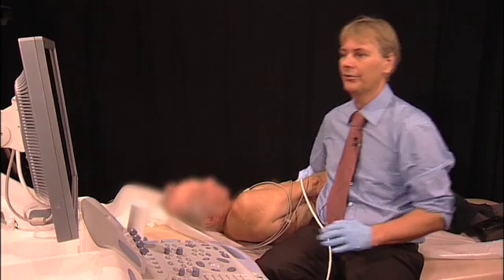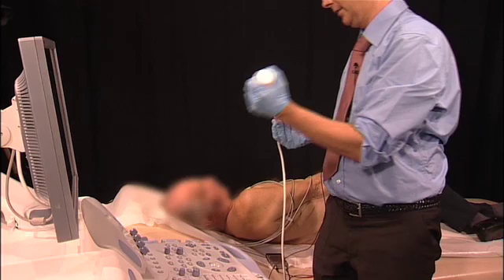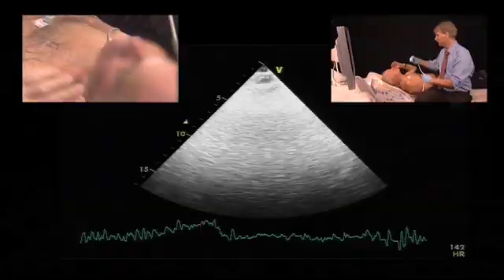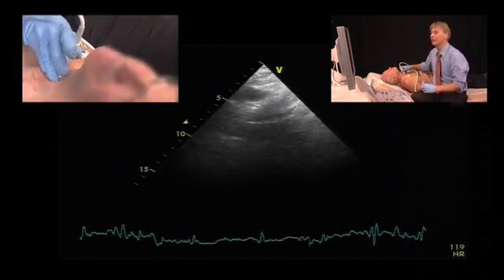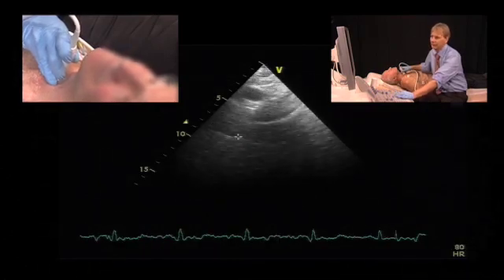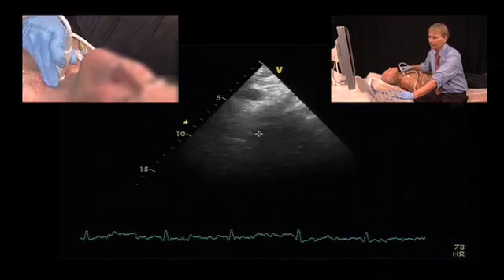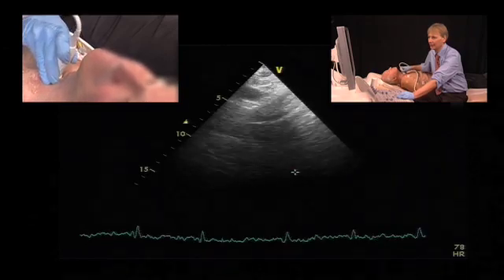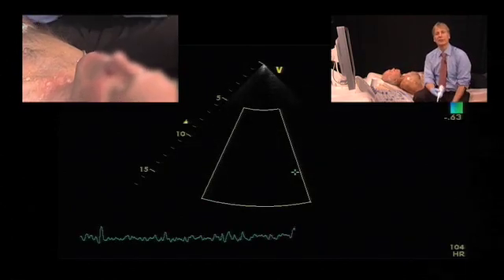The third window, which is also good, is the suprasternal window. From the suprasternal window we can see the aortic arch and the descending aorta. Unfortunately, this patient is not ideal to image from the suprasternal window, but we can identify the ascending aorta, the aortic arch, and the descending part of the aorta. So we can see several segments from a transthoracic approach.